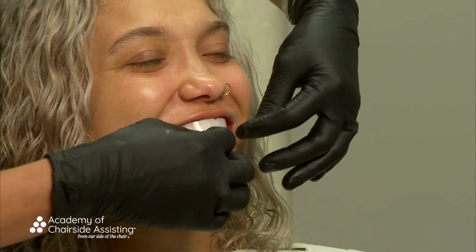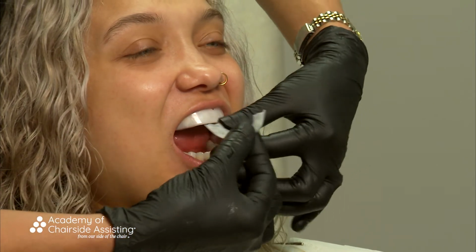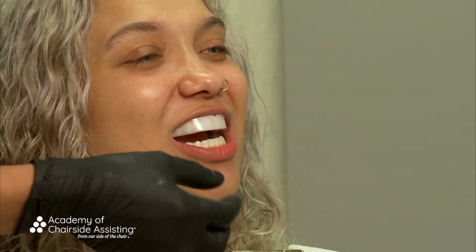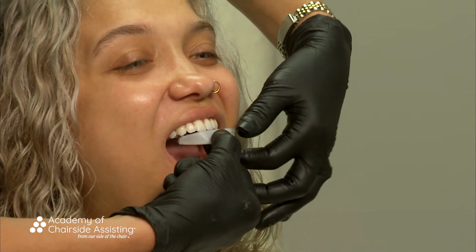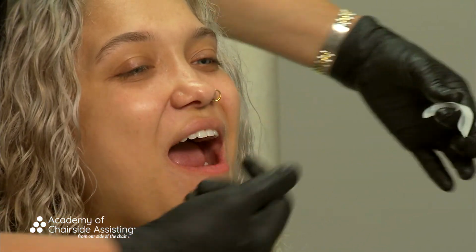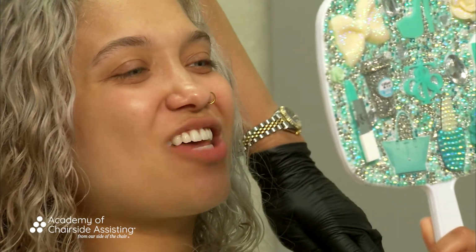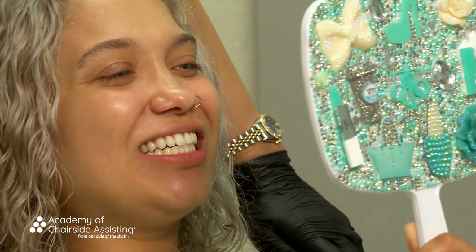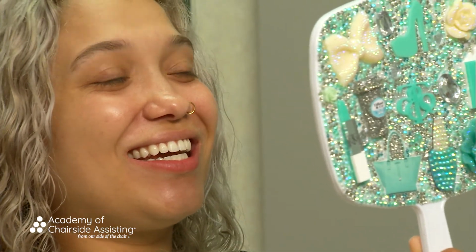Now it's been 20 minutes. I'm going to take out, open for me just a little bit. I'm going to take this out, okay? Just the lower. All right, and then I'm going to take out the upper tray. Now, it's a little gooey, right, because it's been sitting on your teeth, and really that whitening agent is melted. But, wow, what do you think so far? I can already tell a difference. Looks really good, especially for just 20 minutes.